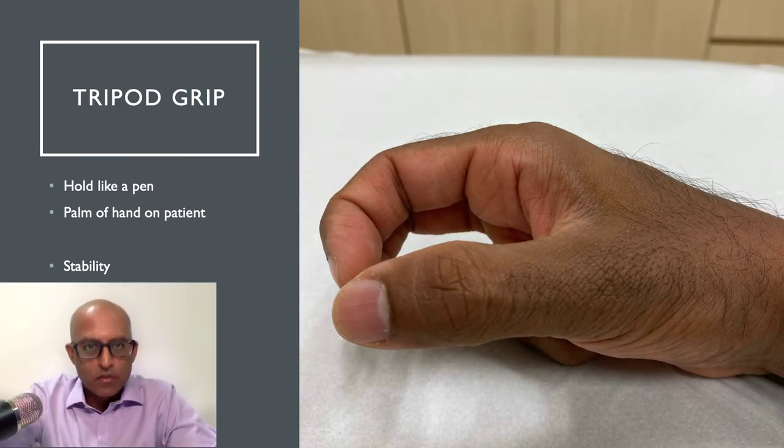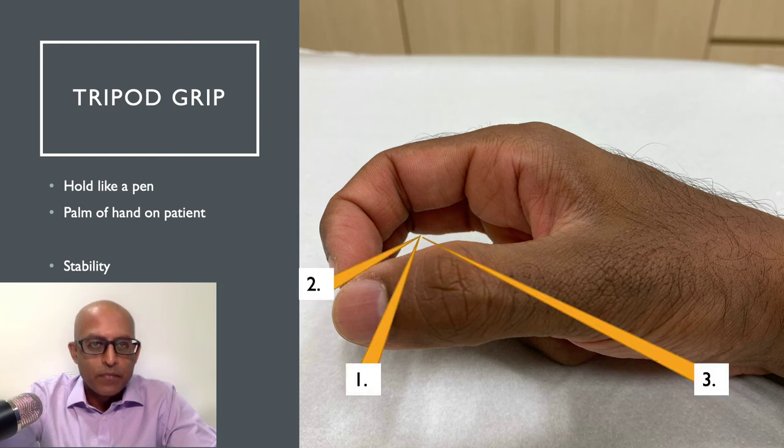If we take the transducer away, you can see the shape my hand forms when holding it. As mentioned, this provides the tripod grip with two points of contact on the transducer and one on the patient. It allows you to have the most stability when you're performing your imaging and will hopefully give you the best image quality possible.